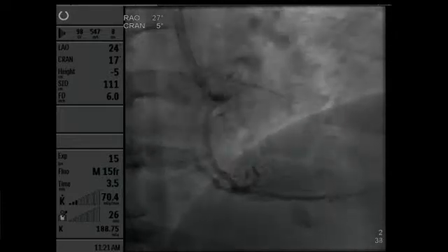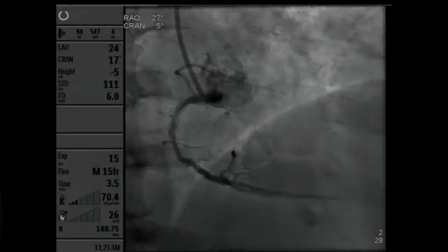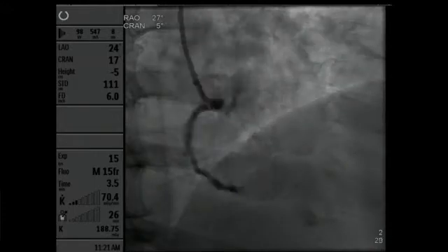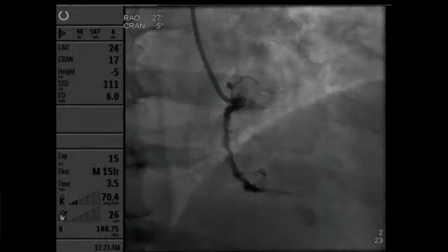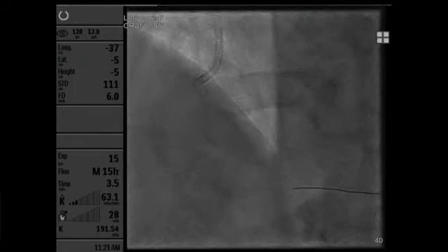My concern about OCT in this lesion is that without pre-dilating, you're not going to get a great image possibly. Yeah, true. So I'm going to go in first and see if we can generate a good picture here. Probably you will be okay. Yeah, I take your point, Dr. Schlafmitz. I think I'm a bit more encouraged by the RAO view. I think it's an eccentric plaque that will hopefully be an oval shape on OCT. We'll see.